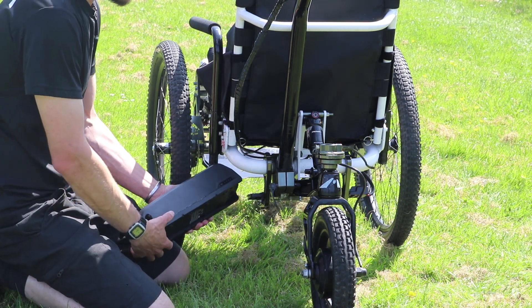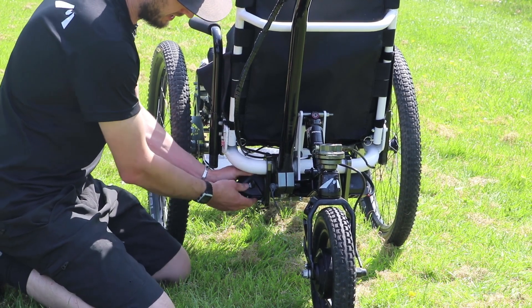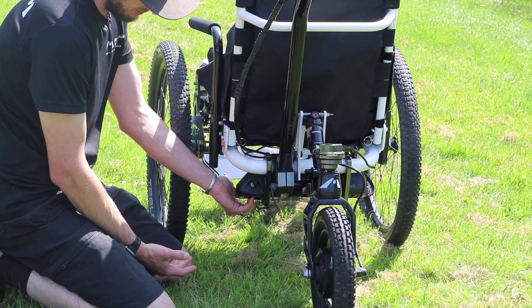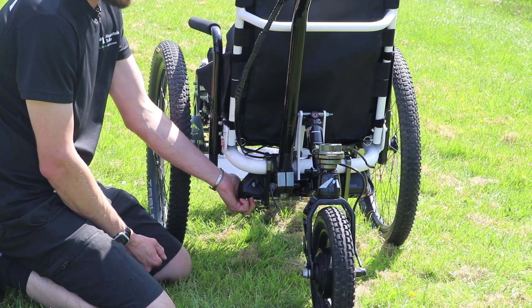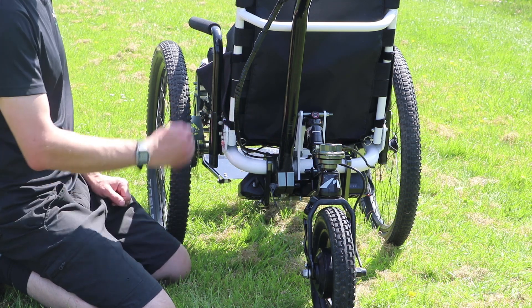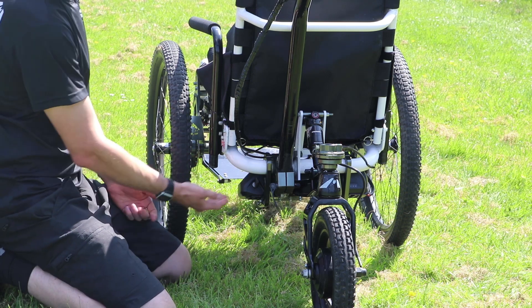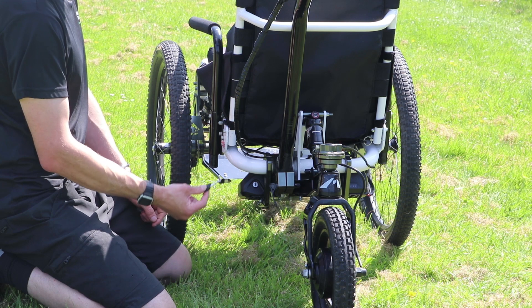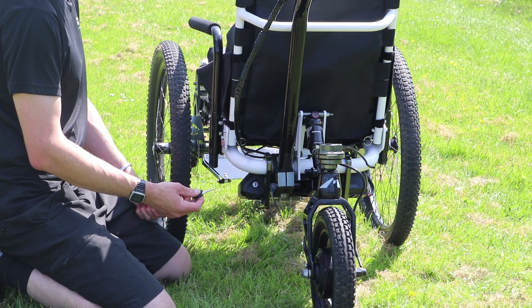Slide the battery into position on the mount. My technique is to grip the underside of the mount with your fingers and then push with the heel of your hand. You'll then feel a very definite click as it slots into position. You'll also see on the opposite end of the battery near the switch that it is completely flush with the battery mount. You can ride the trike with the key left in position, but it's probably a good idea to take it out and keep it somewhere safe. You should have received two keys with your trike — keep those separately so you have a spare in case you lose one.